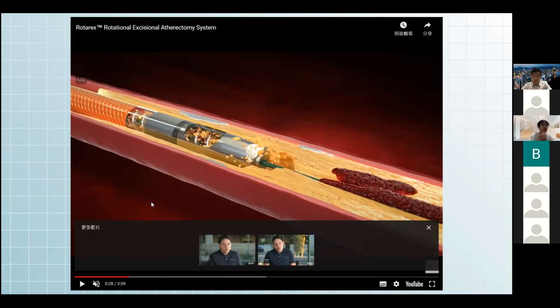So with the mentioned imaging technology, you can actually better visualize what sites you will want to do different types of interventions on. And in this case, you can better use atherectomy, for instance, as a new means of actually removing the atherosclerotic plaque that is otherwise not visualized by all the forms of technology, or even echocardiogram. Those essentially cannot show it. So here's a video explaining what atherectomy is. So please enjoy.